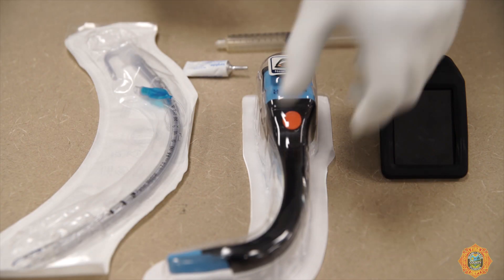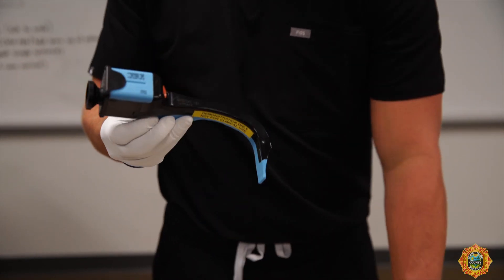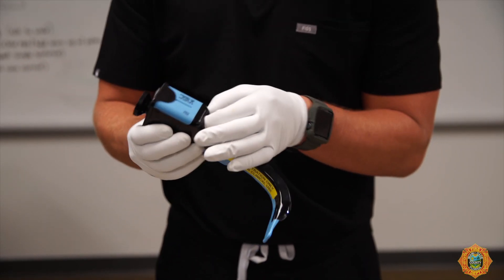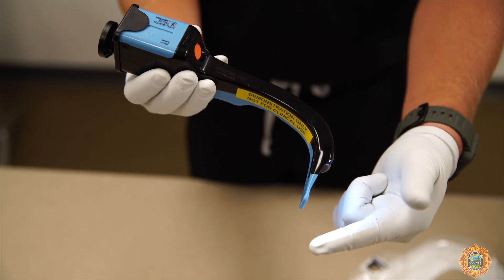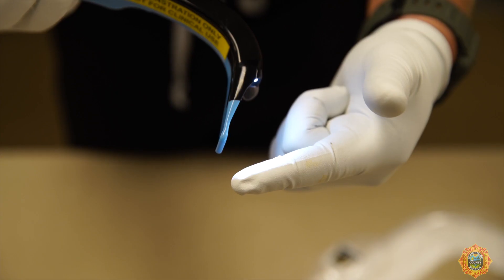Let's take a look at the procedures for visual laryngoscopy. Select the appropriate size AirTrack SP according to the size of ET tube to be inserted. Press the orange switch located below the battery cover to turn on the light. After 30 seconds, ensure that the light is steady.